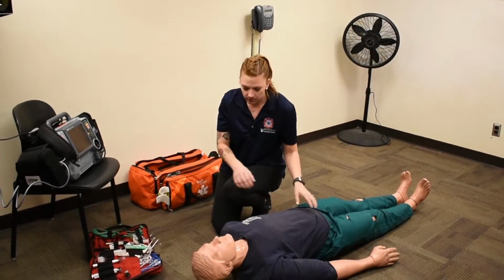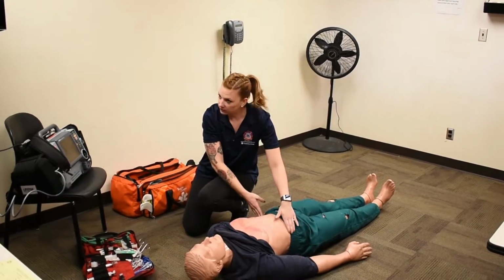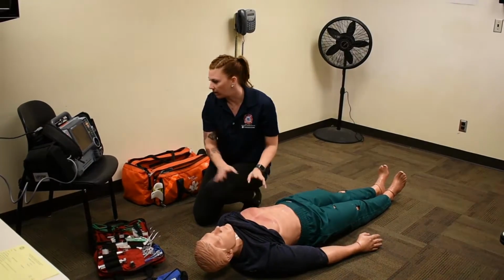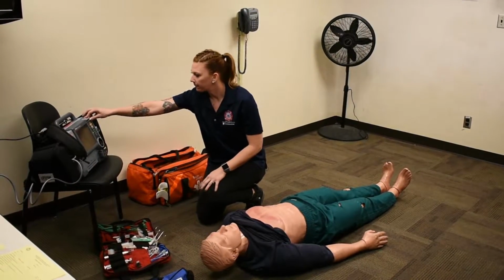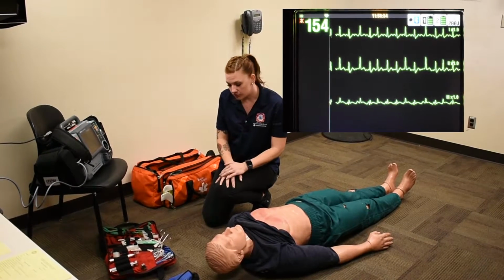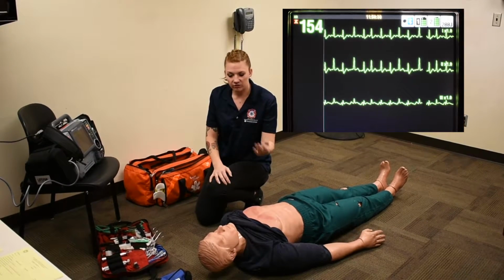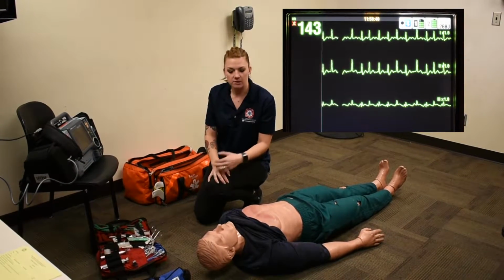While I'm speaking with him, I want to go ahead and put him on my monitor. Since he said his heart was feeling funny, I probably just want to put him on a 12 lead right away and turn my monitor on. Sir, do you have any history of any cardiac issues or anything to that effect? Patient states no.